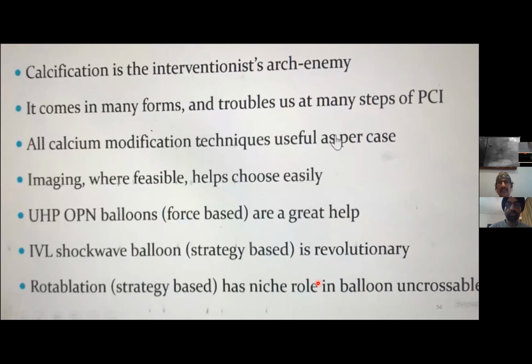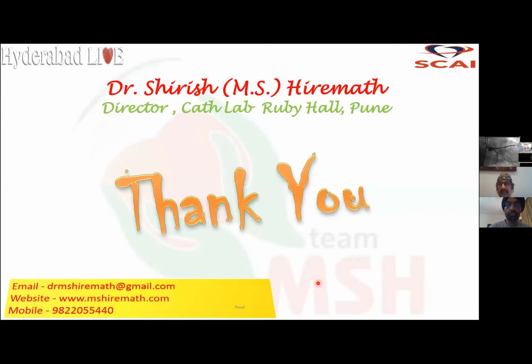So calcification is the interventionist's arch enemy. Imaging really, really helps you to decide what is going to be your best option. If you don't end up with a nice expansion, we are likely to expect trouble in the immediate hospital stay, or a few months later, with an ISR. Thank you for your attention.